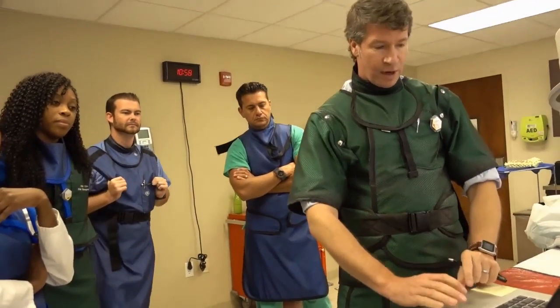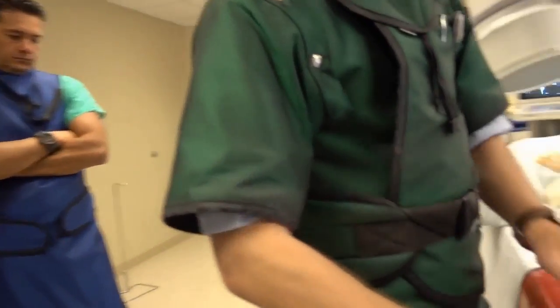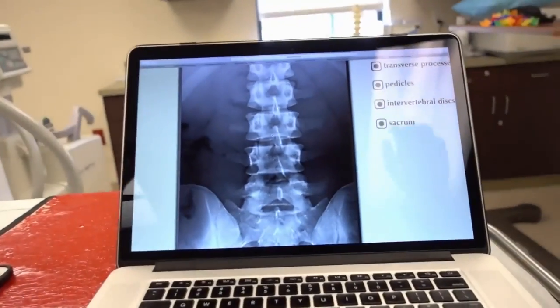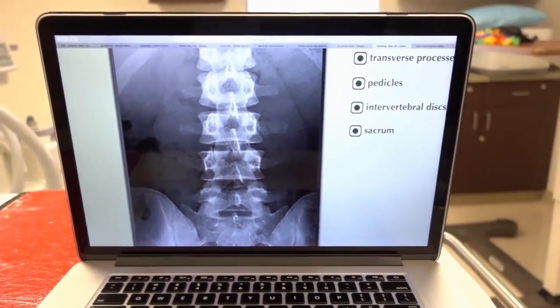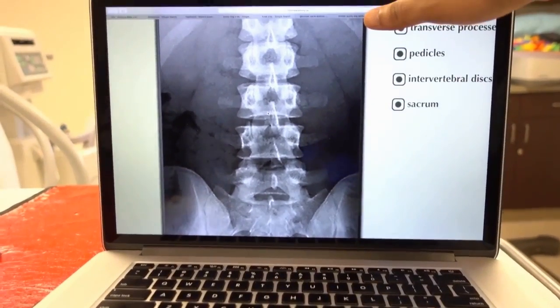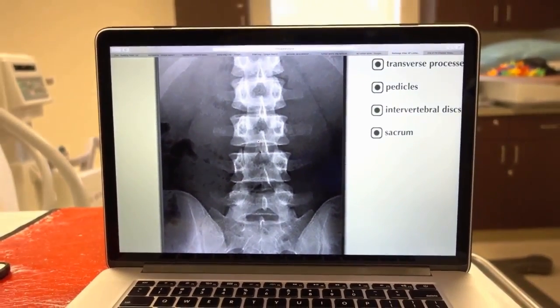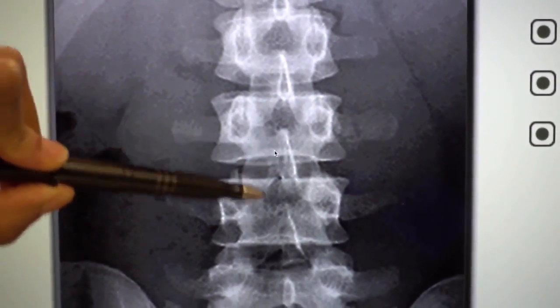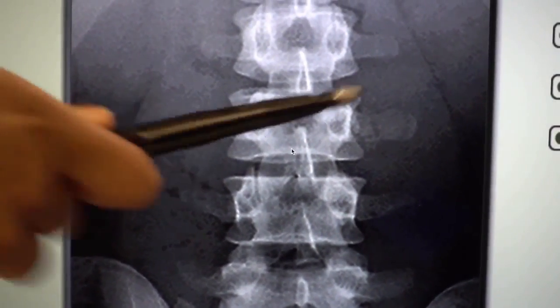Okay, so I brought up an image. Let's have a look at this image there. Now, TG, why don't you just come here and look at this with me. Which one of these, and I'll give you the pointer, does not look like it's AP? Can you show me? You want me to say what it is? Yeah, sure. Tell me. So I'm thinking L3. Yes. And L4, because they are actually going the opposite way.